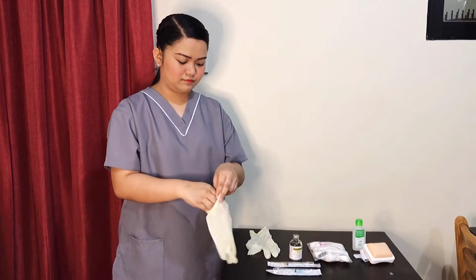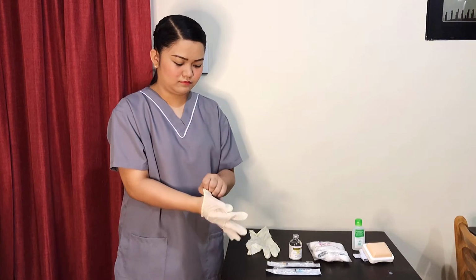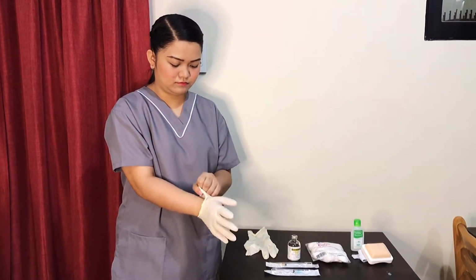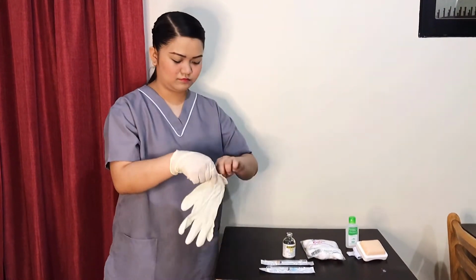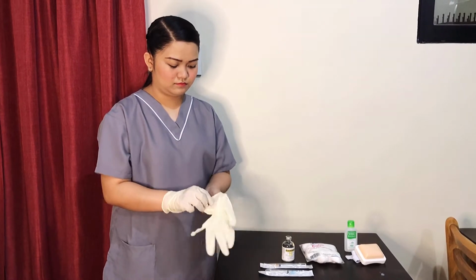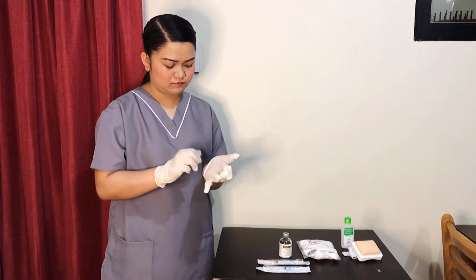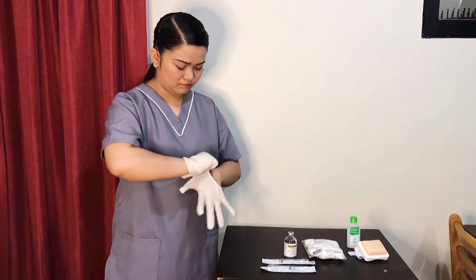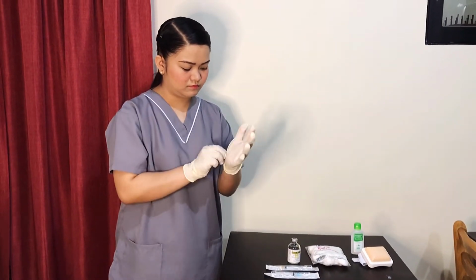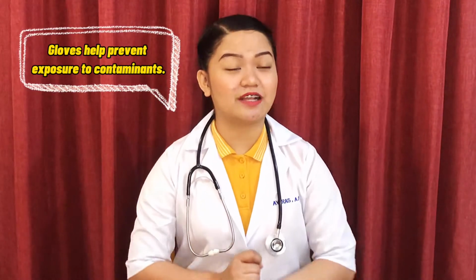And yes, don't forget to don disposable gloves. Gloves help prevent exposure to contaminants.